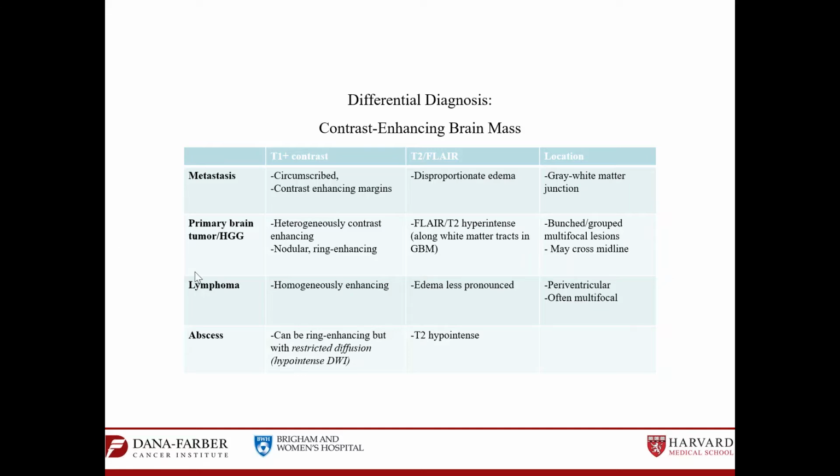If we're looking at high-grade gliomas, it's usually heterogeneous in contrast enhancement, and it has a very significant component in FLAIR and T2, and that's what guides us to delineate our tumors, so we have to chase all the edema. Some institutions don't do that, but here we chase the FLAIR and T2, so we make sure that everything is encompassed in our GTV.